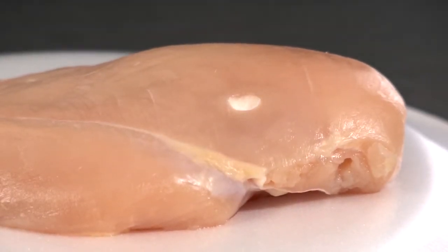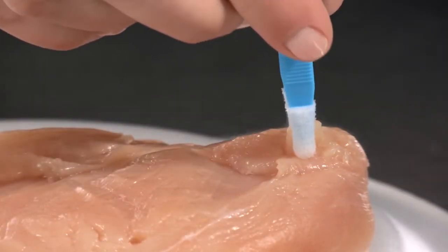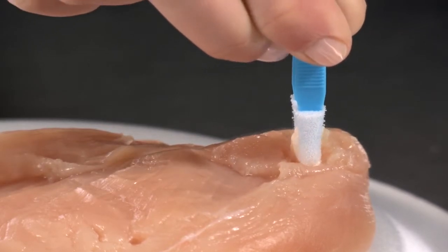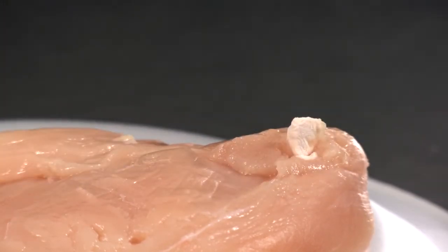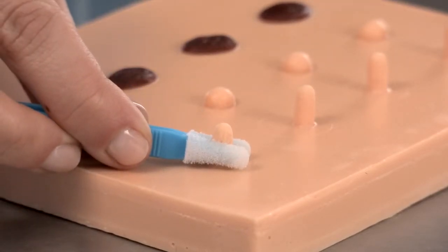Application time will depend on size and location of the lesion being treated. If using a skin tag tweezer, the entire tag can be frozen by squeezing for 20 to 40 seconds, or the tweezers can be applied at the base of the stalk to eliminate the blood supply to the tag.